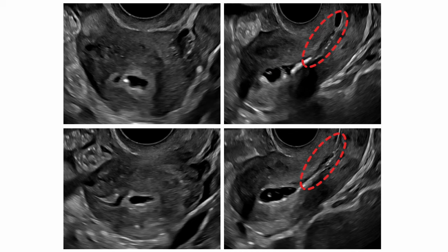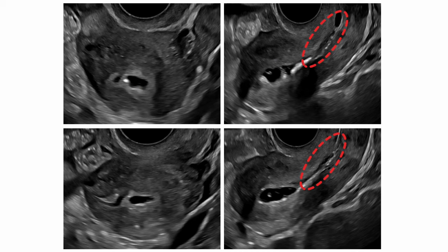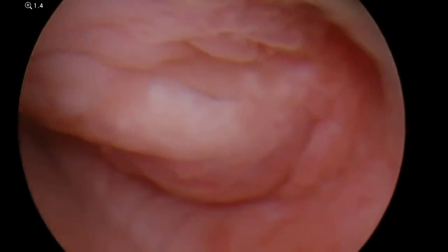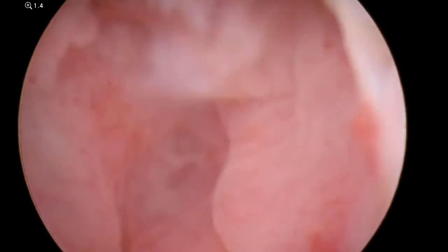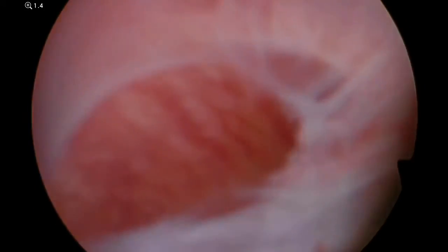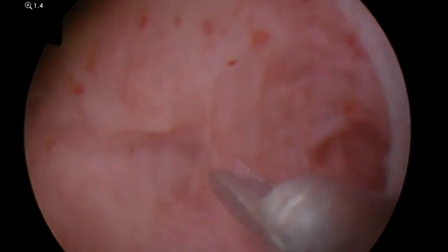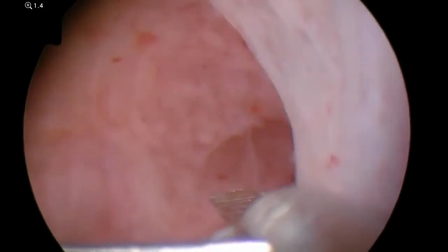It is important to note that imaging findings do not always correlate well with hysteroscopic findings. On second look, the endometrium appears much more healthy, consistent with progressive regeneration of endometrium. Based on preoperative imaging, lower uterine adhesions are expected. Again, a seemingly short cavity is encountered. The upper border is probed with the tip of the hysteroscope, and eventually the fundal portion of the uterine cavity is entered. Scissors are then used to divide adhesions both at the fundus and in the lower uterine segment in order to completely open up the cavity.